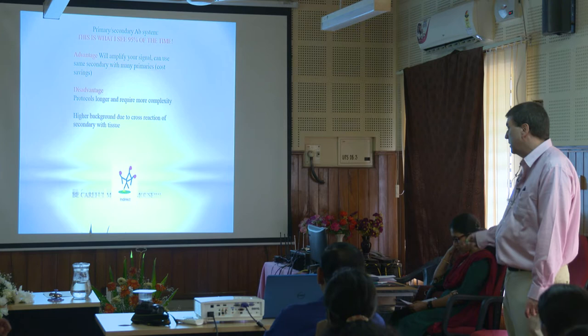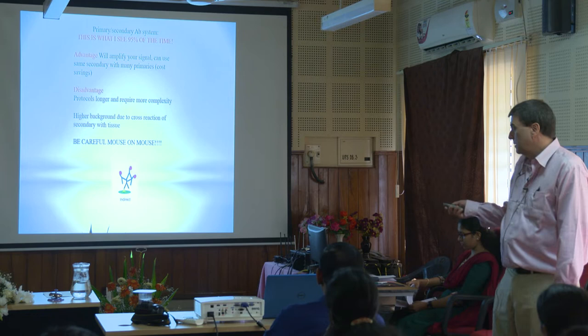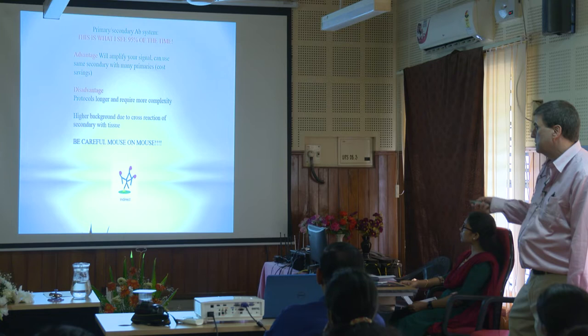Okay. The other one to watch out for is mouse on mouse. And I'll get to that in a minute, I think. Whoops, let's go back. So just keep this in mind. We're going to talk about this in a little bit. But mouse on mouse is a killer, and we'll get to it.